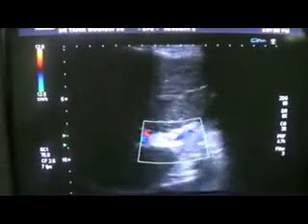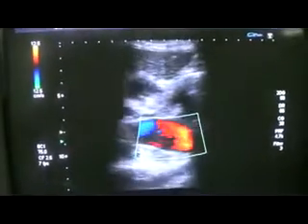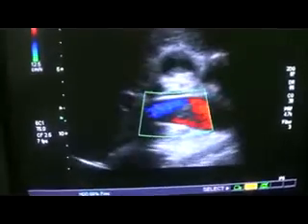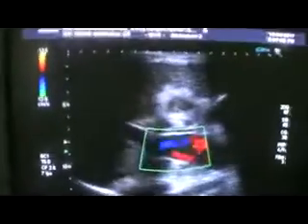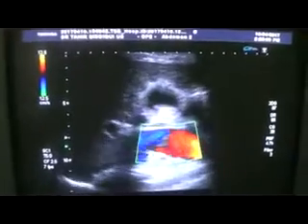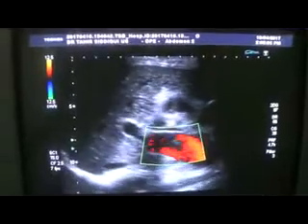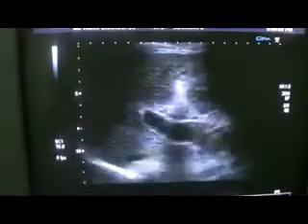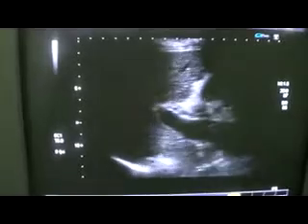Here you see again — it's not a completely obstructive sort of clot, but it is there.